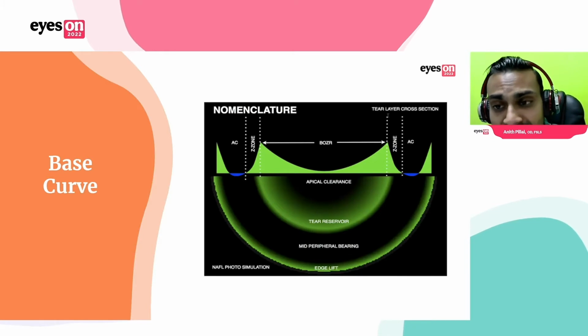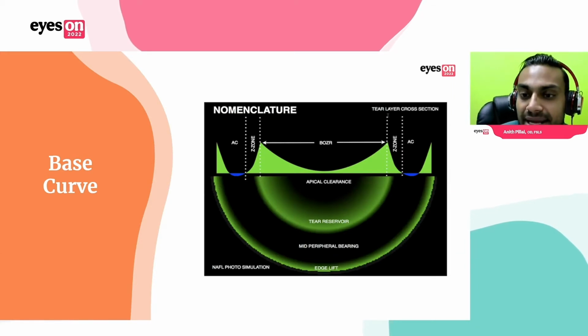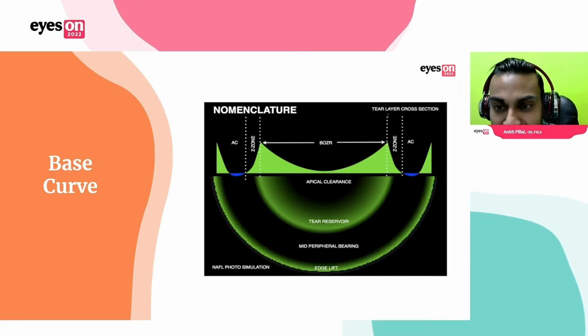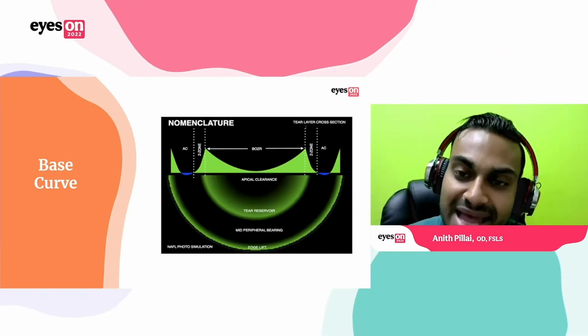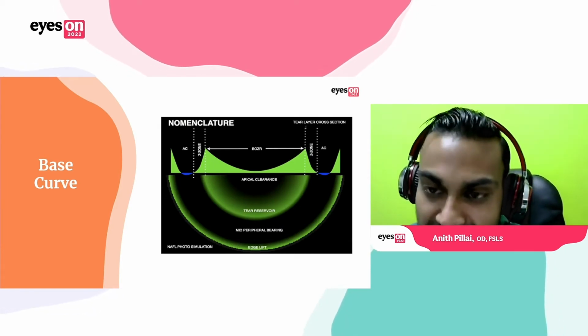Now, it'll look like bearing on slit lamp. The reason for that is the molecular weight of sodium fluorescein. When you put that fluorescein dye in at the slit lamp and view what the RGP looks like, unless you have 20 to 25 microns of clearance, it'll appear like bearing. So when you see bearing at that central base curve, you likely don't have compression. You'll still have a very thin layer. It's just under that 20 to 25 micron threshold of what we can visualize at the slit lamp.